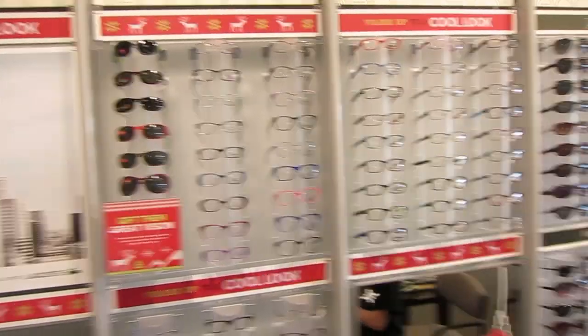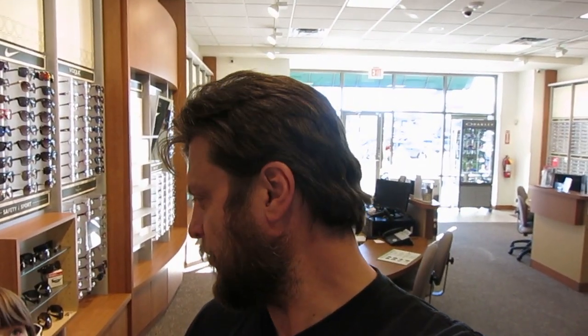Presley was telling us her vision wasn't so good — she was having trouble reading signs and maybe reading the board in her Friday classes. So we decided to get her eyes checked to see if she needs glasses. We've got a Google full of glasses here, so we'll do the eye exam first and if she needs some, maybe you guys can help us pick out a pair.